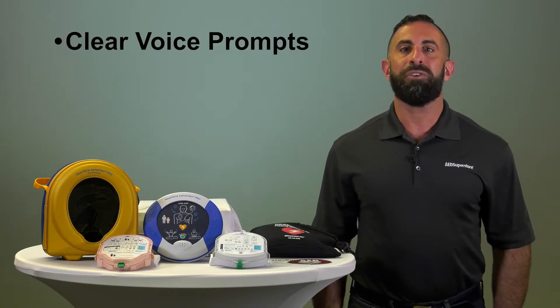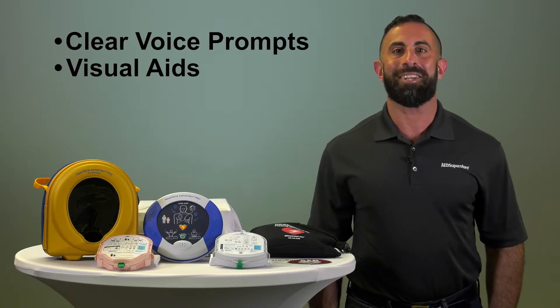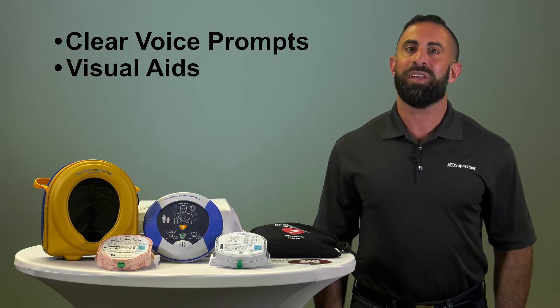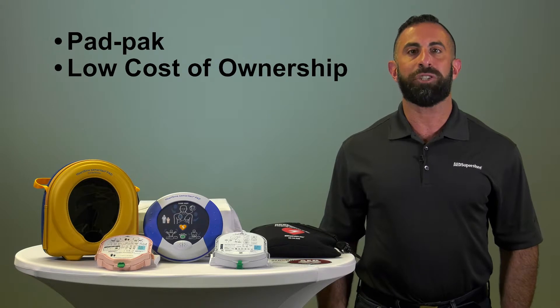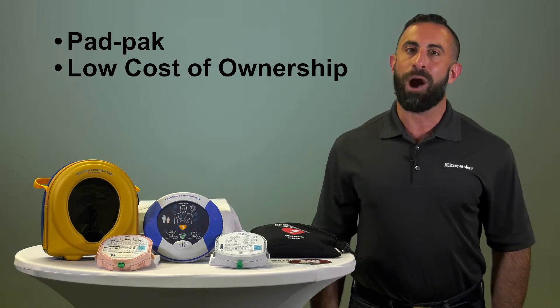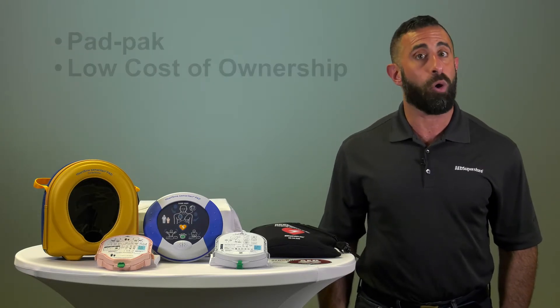Both devices are easy to understand and use clear voice prompts as well as visual aids that guide the rescuer through the entire process. The 350 and 360p use an electrode pad and battery combination called a pad pack. The pad pack has a four-year shelf life with over six hours of continuous monitoring or 30 shocks.